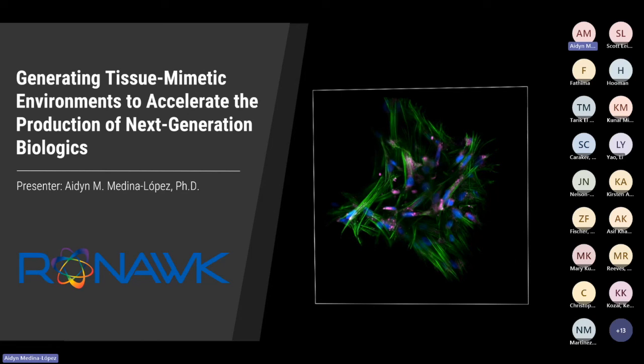As I mentioned, it is 1 centimeter cube. So penetrating light throughout the entire bioblock is very difficult. Nevertheless, we're working in partnerships with, in this case, Nikon, to help improve this problem. And so far, we have gone to almost 5% deep into the bioblock. And we continue to improve this with more days that we are practicing our imaging techniques with the bioblock.